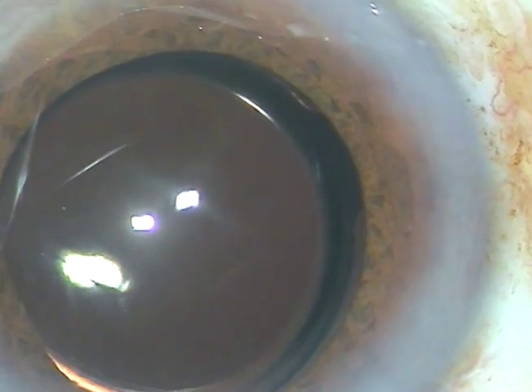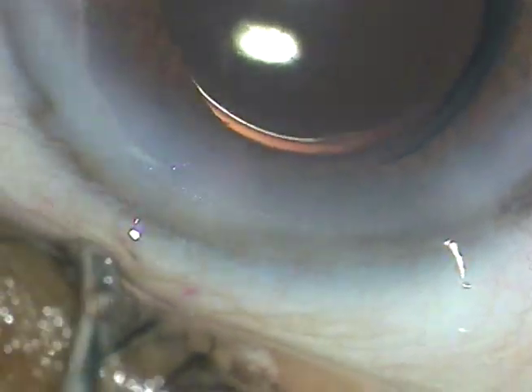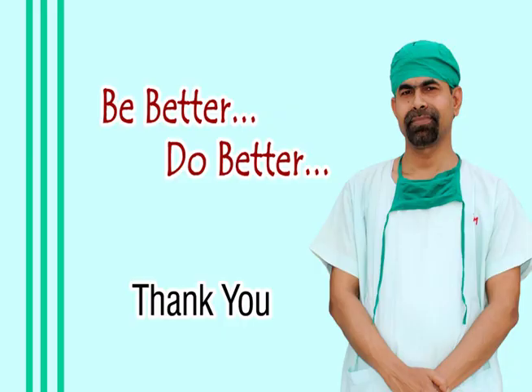Now we must check the integrity of the wounds — there should not be any leakage from any site. Thank you very much for watching. Hope this video will help you in developing your surgical skills, improving your surgical skills, and doing a great service to mankind. Thank you very much.